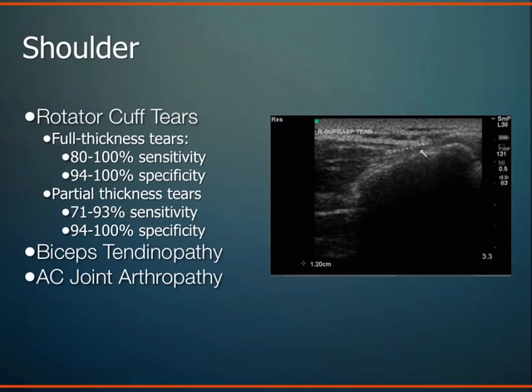So around the shoulder, this is an area that has been studied a lot because it is a very common diagnosis and clinical complaint. Shoulder pain, shoulder impingement, rotator cuff tendonitis. A big reason why patients come into the clinic, and a big reason why we order a lot of MRIs. And so people are trying to find out, can we use ultrasound in the office, avoid MRIs, avoid healthcare costs, and is it a reliable modality to diagnose these rotator cuff tears or rotator cuff tendinopathies?